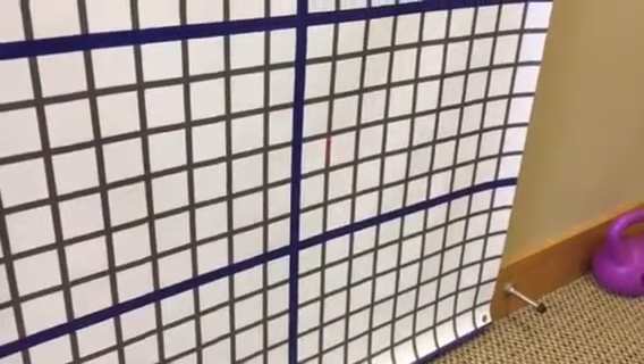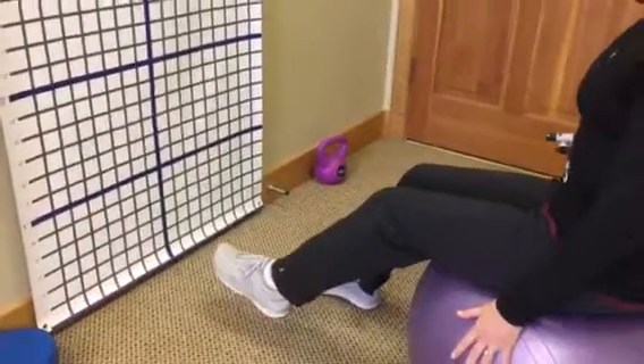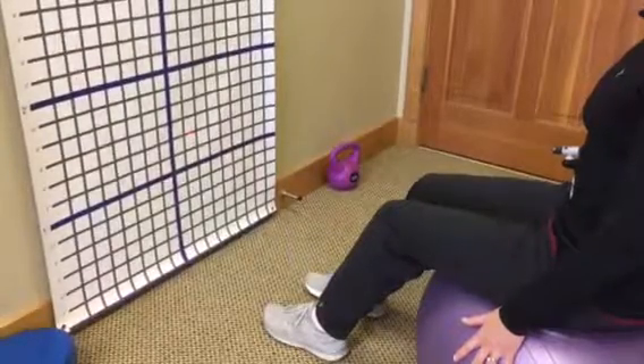So you can see as I lift my leg up and down, I want to try to stay as still as possible. It's going to move a little bit, but we just want to have good control.